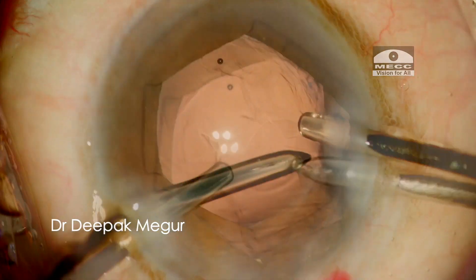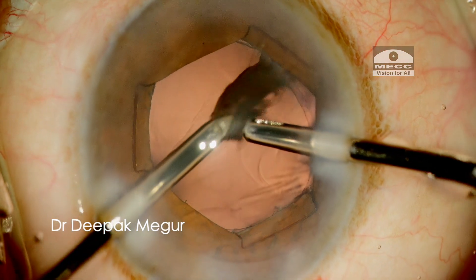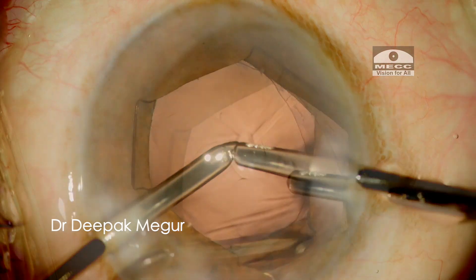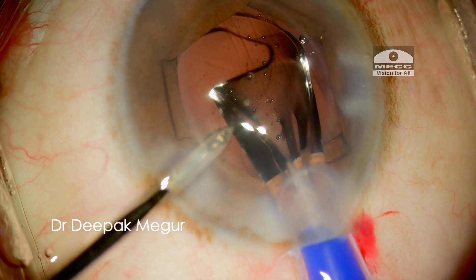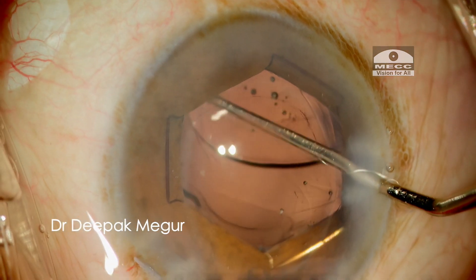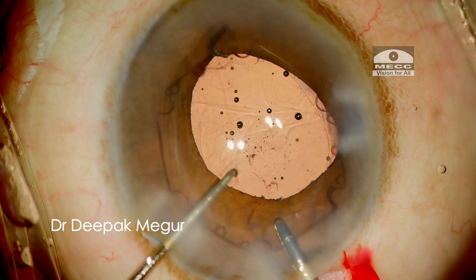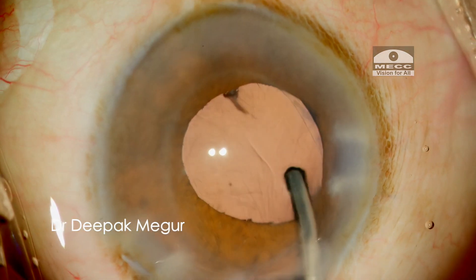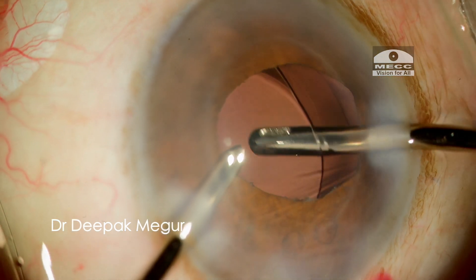After the final quadrant is emulsified, the remaining cortex is aspirated. The intraocular lens is placed into the bag under the cover of viscoelastic. Before removing the OVD, the B-hex ring has to be explanted — and it's extremely easy to do so. Just disengage the ring and remove it in a single shot. Then the OVD both in front and behind the lens is removed.